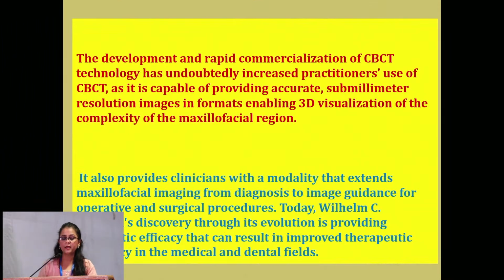So the development and rapid commercialization of CBCT technology has undoubtedly increased practitioners' use of CBCT, and it's capable of providing accurate sub-millimeter resolution images in formats enabling 3D visualization of the complexity of the maxillofacial region. It has actually been a beneficial tool for improving the therapeutic efficiency in the medical and dental field.